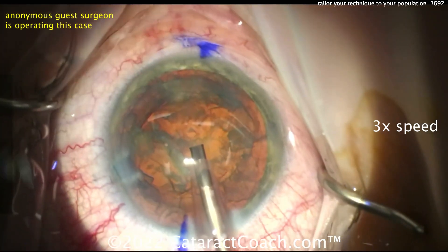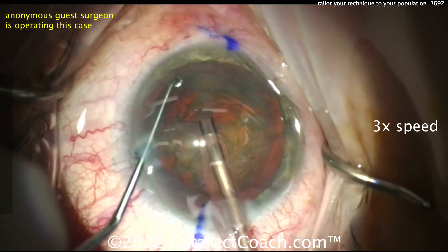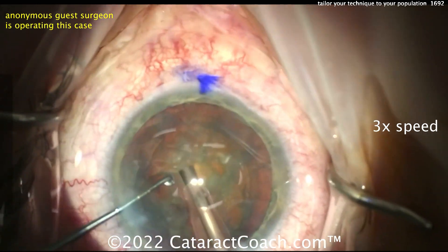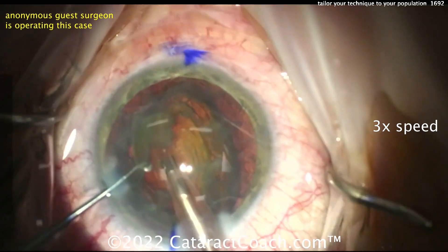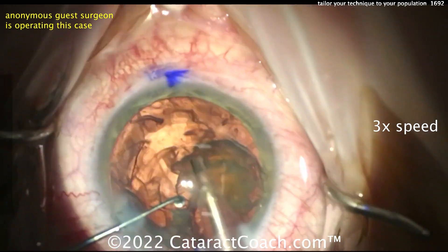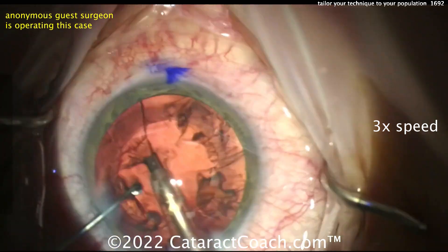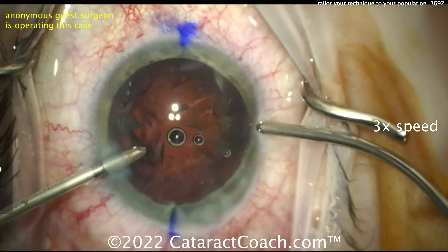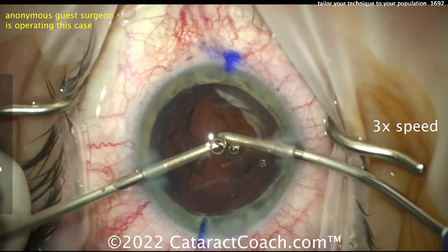But you may say, wait a minute — I'm in this part of the country or this part of the world and my normal is 4-plus NS. I normally get brunescent cataracts every week, dense white cataracts every week, and root beer or Coca-Cola type cataracts. Tailor your technique to that population. If this surgeon gets a population like what I see in Beverly Hills, this technique is ideal. But if you've got a different patient population, you should do the same thing — tailor your technique to the population you serve.